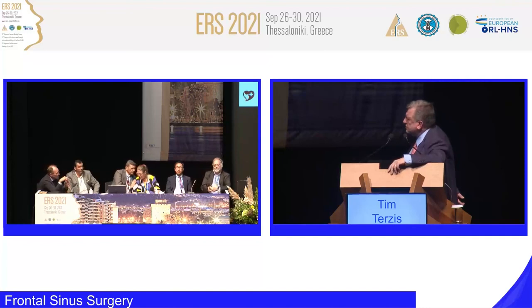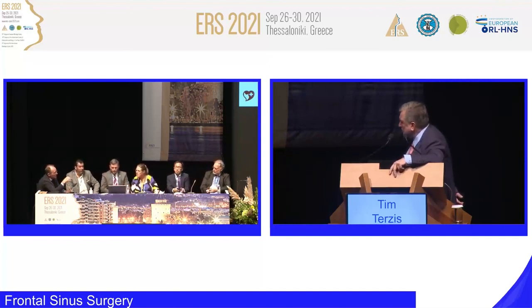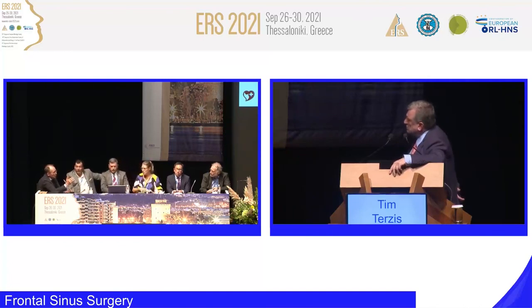Okay, Andreas. Tim, a short comment. I mean, when I make my patient selection, my indication, I base it on 3 columns. First is, of course, the history. Second, I look in the nose, a simple endoscopic finding, 0 degree, nice endoscope, and then I make a CT scan or MRI, and this is the next step then to decide what to go on. And I agree with Wytske. If there's any suspicion for inverted papilloma, something strange, yes, but it can be a very simple scarring. You open and yet... Yes.